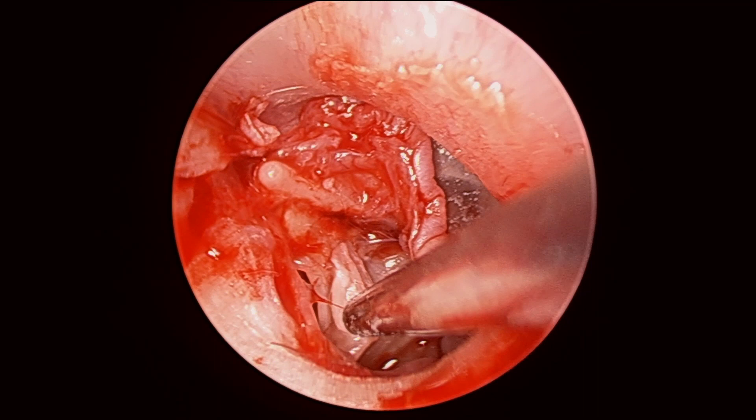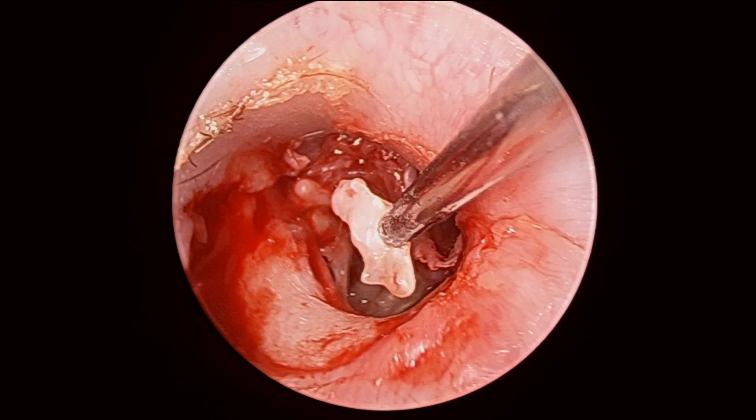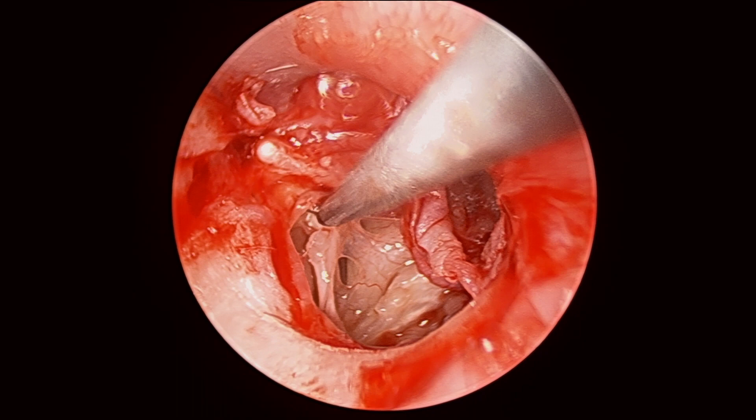The surgery begins by removing the free cholesteatoma off the stapedius tendon and the incudostapedial joint. The IS joint is divided using a joint knife and the incus is removed.